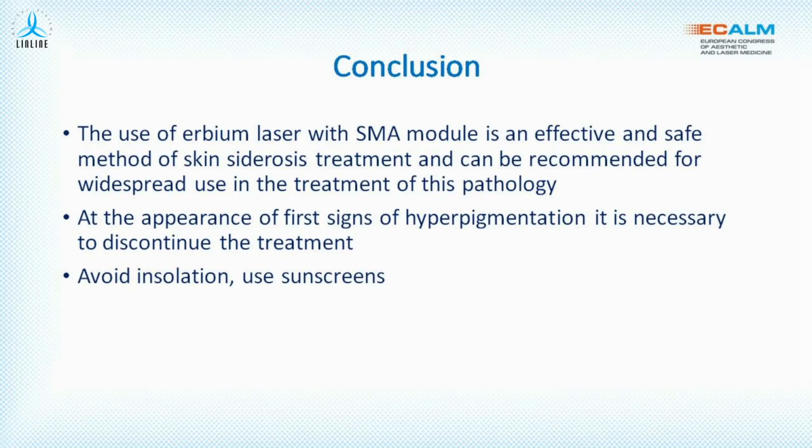As a result, we concluded that the use of an erbium laser with the SMA module is an effective and a safe method of exposure for correcting the skin pathology given, and it can be recommended for widespread use.